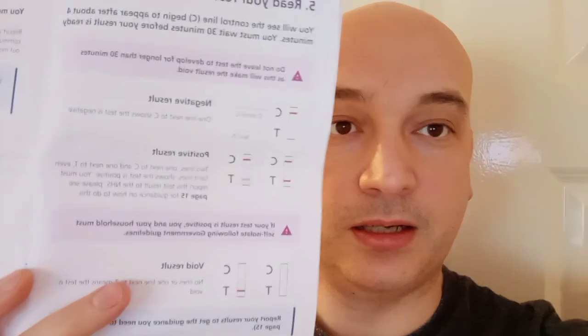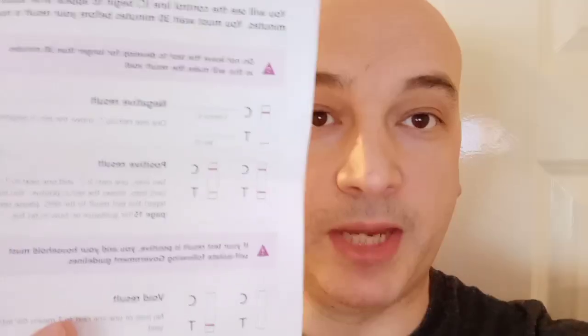So it's been 30 minutes and we will have a look at the test. Here's the test. It's got a single line next to the C. Looking at the guide, that means negative. Yay! There's your rapid flow test.